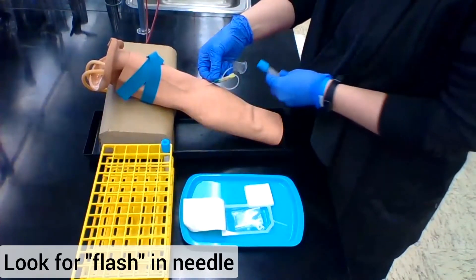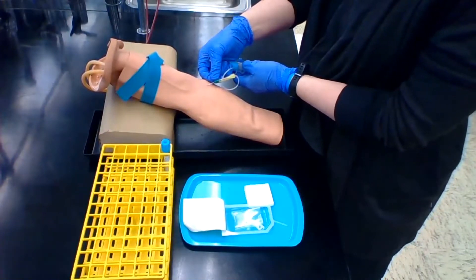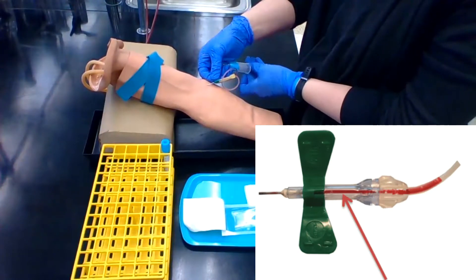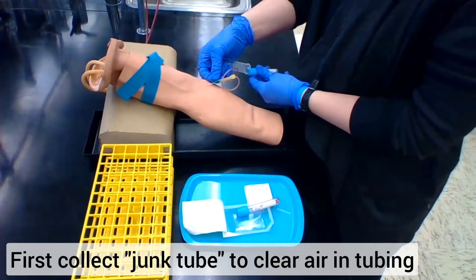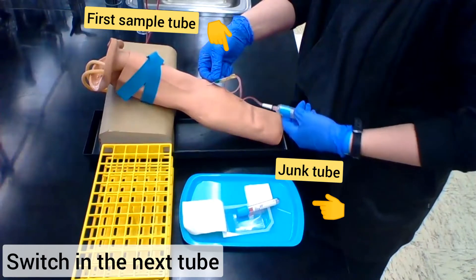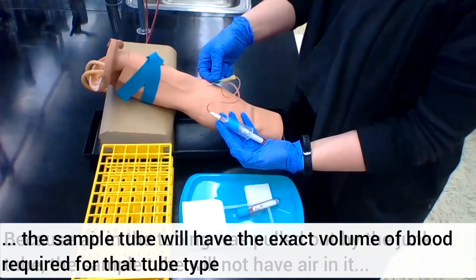The best part about a butterfly setup is that you will know right away if you hit that vein, because you will get what is called a flash — that's just when blood enters into that first little chamber in the needle. Because the butterfly tubing is full of air before you put a tube in, you need to take what's called a junk tube. That way when you go to fill your actual tubes, no air bubbles will get into your sample.